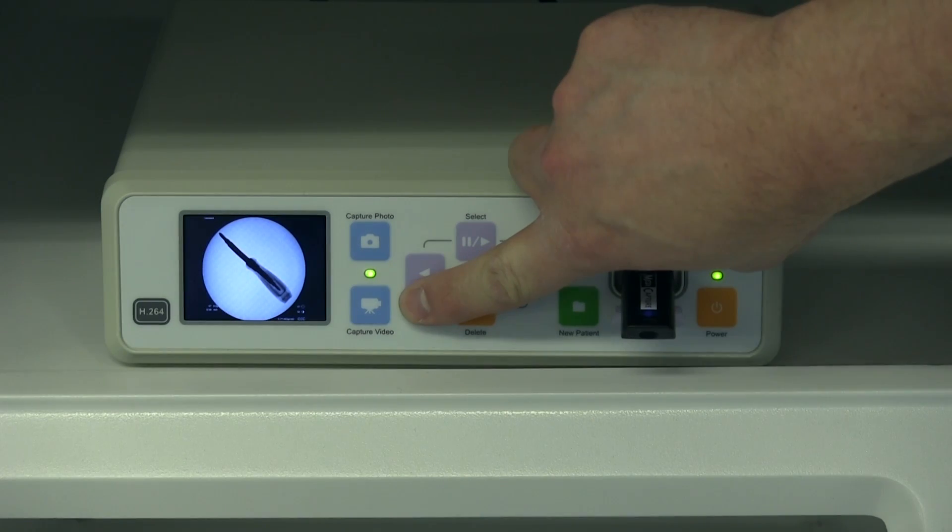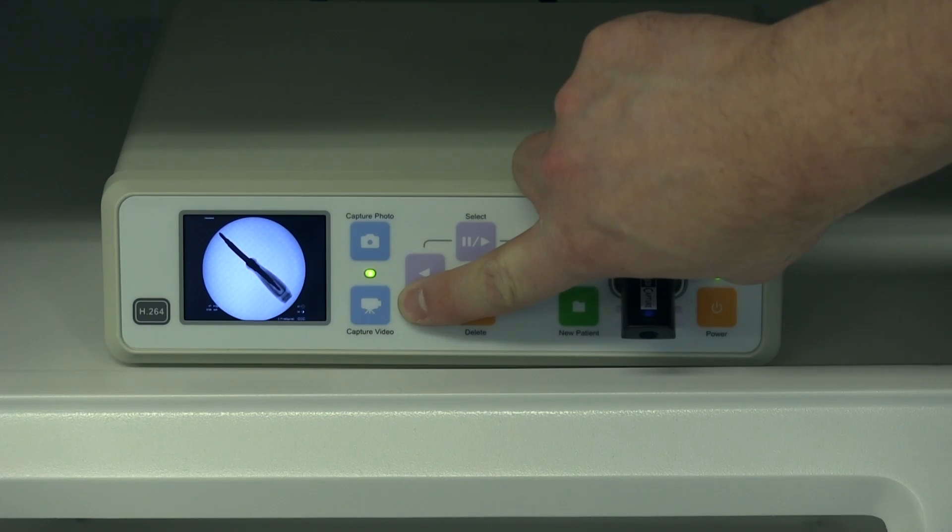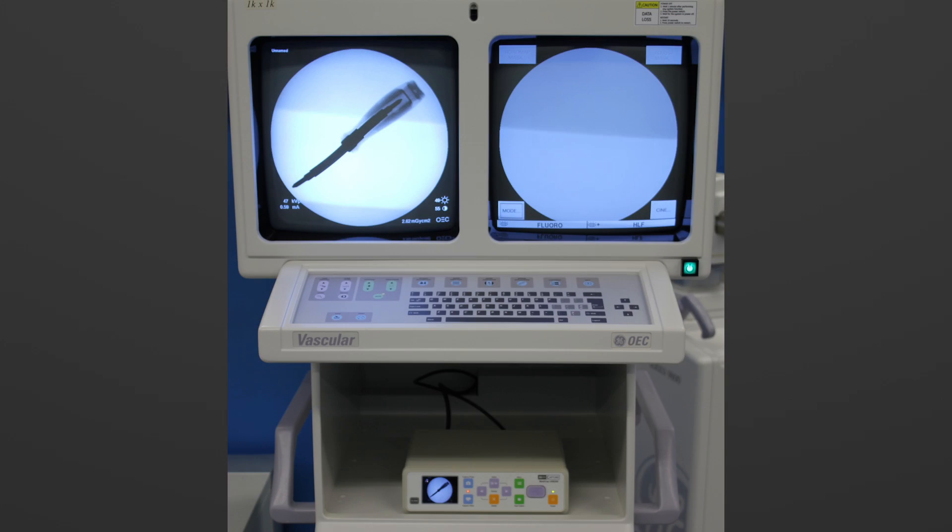Press capture video at the beginning of the time frame you would like to record and press it again at the end. Your flash drive can now be removed and plugged into any USB-compatible computer for images to be stored either on a hard drive or on your PACS system.